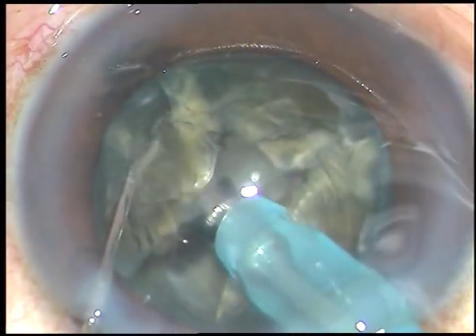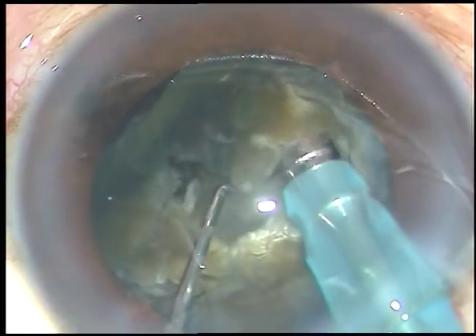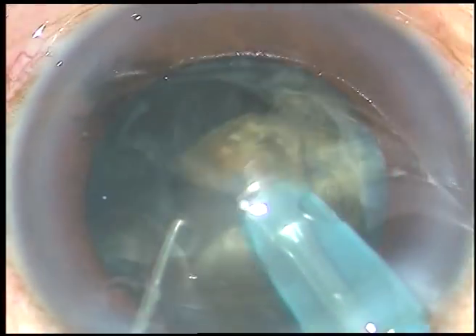Now each hemi-nucleus is emulsified. This hemi-nucleus has been chopped into two parts, and then each hemi-nucleus is subdivided, emulsified, and taken out.